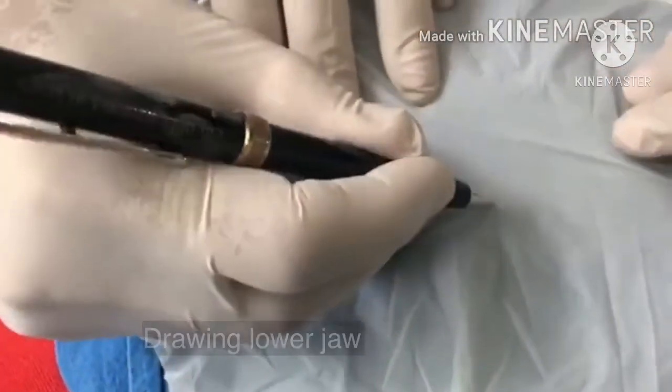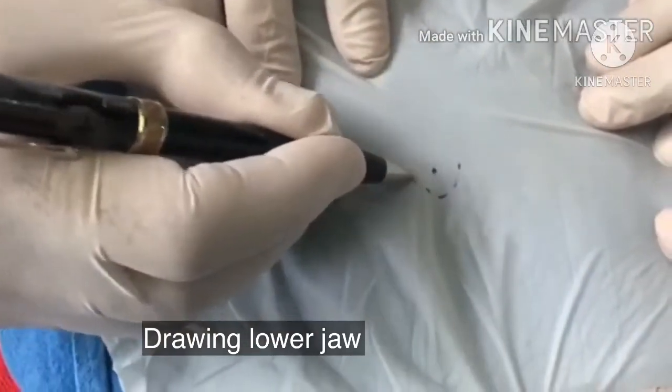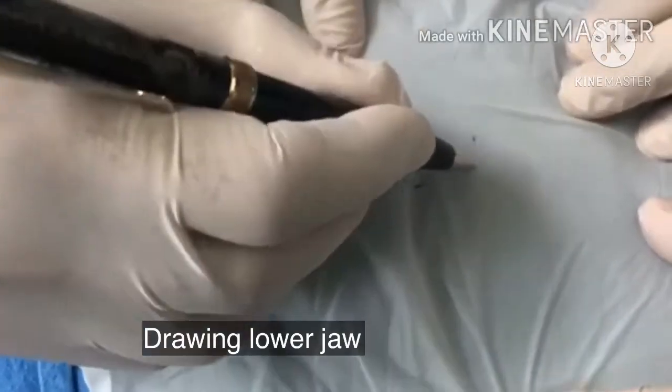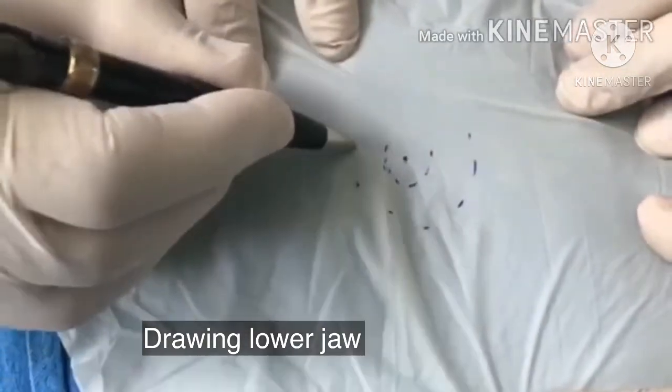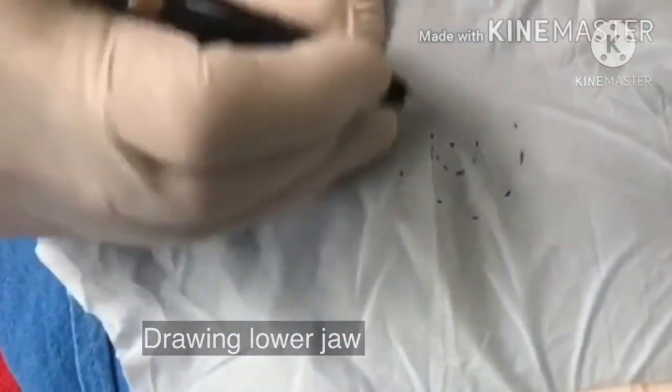Then we draw the lower jaw. Mind you, the circle I am drawing is narrow and it is not wide as it is normally depicted. So it is essential to draw this circle and mark the tooth.